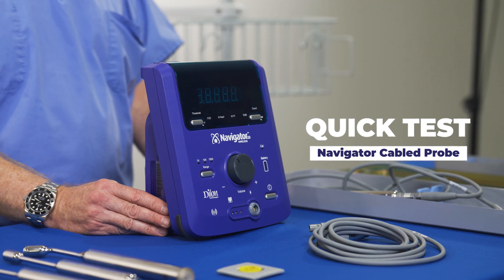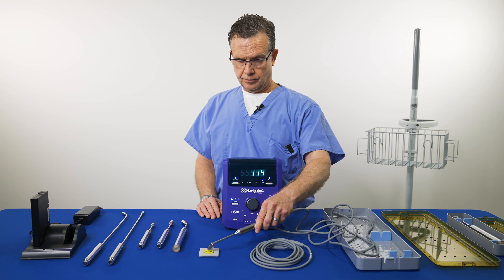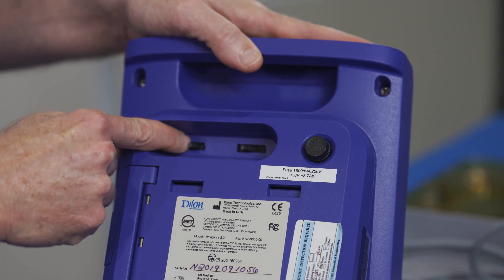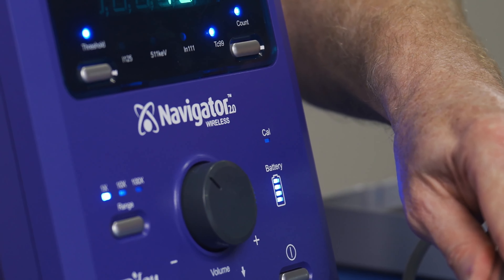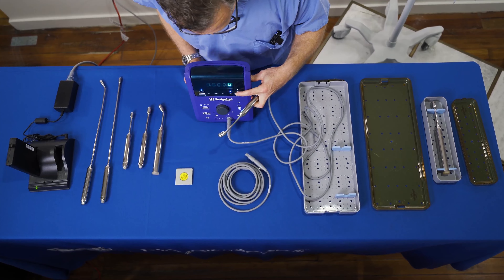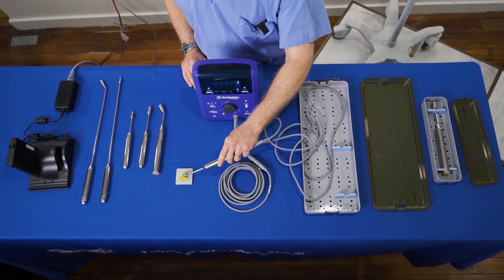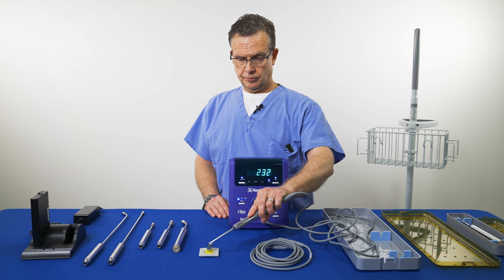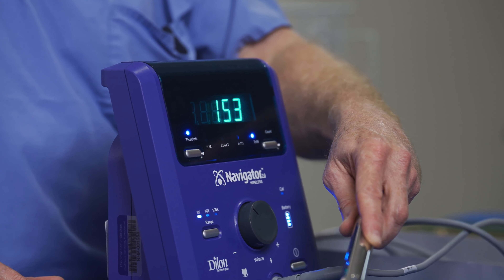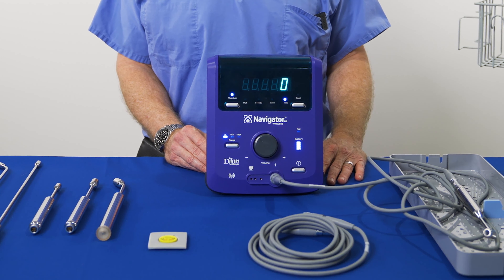Every six months, perform this quick test to make sure the cabled probe is in optimal working condition. Using a test check source, set the switch to the positive setting — the calibration light will blink indicating test mode. Press the 10-second count and record the number. Now set to the zero setting, repeat the 10-second count and record. Then set to the negative setting and repeat. The counts on the zero setting should be higher than at the negative and positive settings. The exact count number does not matter as it depends on the activity of the radiation source. After testing, turn the knob back to scan mode; the calibration light turns off and the system is ready to use.